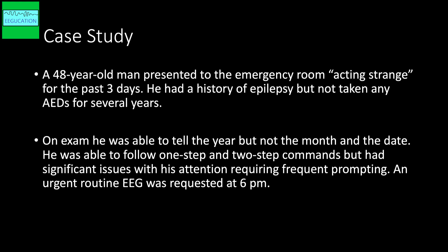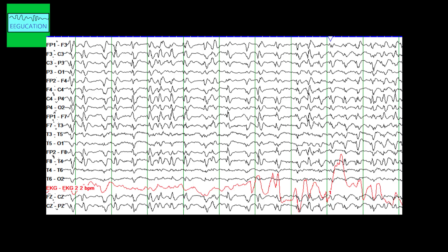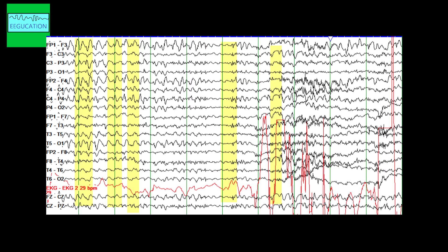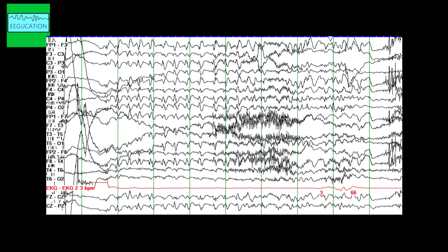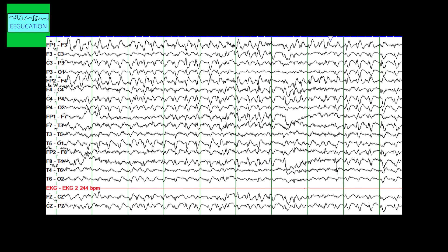The key point is that if somebody did not know this patient, looking at him from a distance you would not be able to say anything was wrong. Only the family members who lived with him mentioned that this was not him — he had been acting very strange for three days. An EEG was done, and what we found — with the gain cut down — was spike-and-wave in a generalized distribution. I gave him some Ativan and there was some attenuation of the spike-and-wave for a little while, but it came back. The spike-and-wave was basically continuous for 30 to 40 minutes, and he could speak and walk during this time.